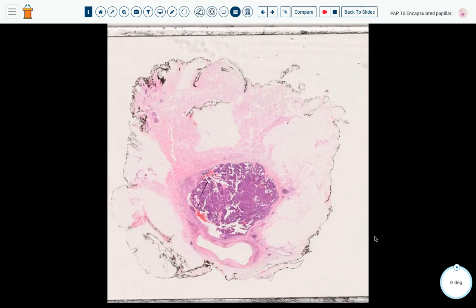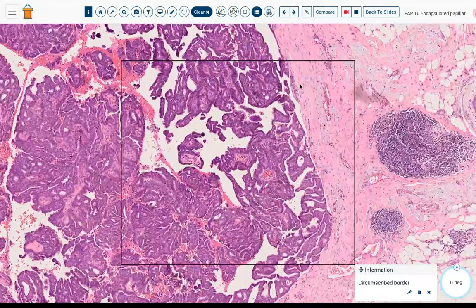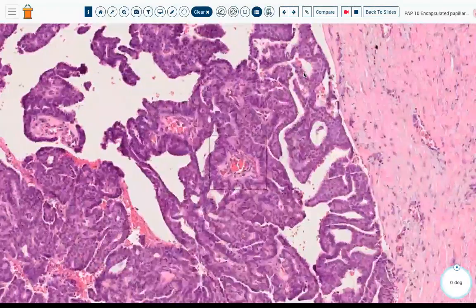So here it is. So this is sort of a classic type. So it's a single solitary mass sitting in a space. When you look at the edge, actually it's hard to tell on H&E, and so normally you would do immunohistochemical markers, but there are no myoepithelial cells here at the edge, and there are no myoepithelial cells in the fibrovascular cores. There is kind of this delicate capsule around the edge.